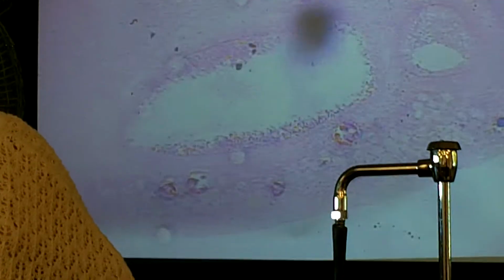It's so big. Check out the edges of it. Here's one edge of it. Here's the other edge of it. It basically spans from one side of the ovary almost all the way to the other side of the ovary. That's all corpus luteum there.